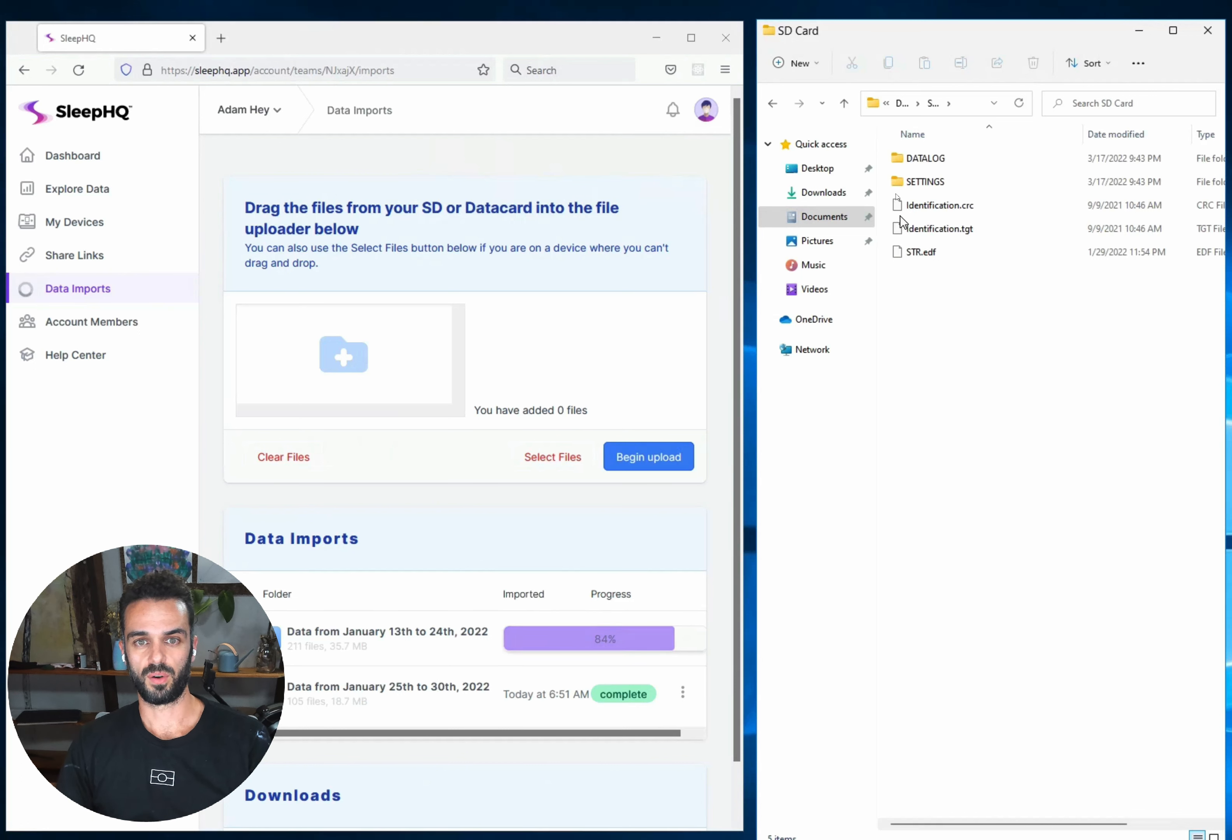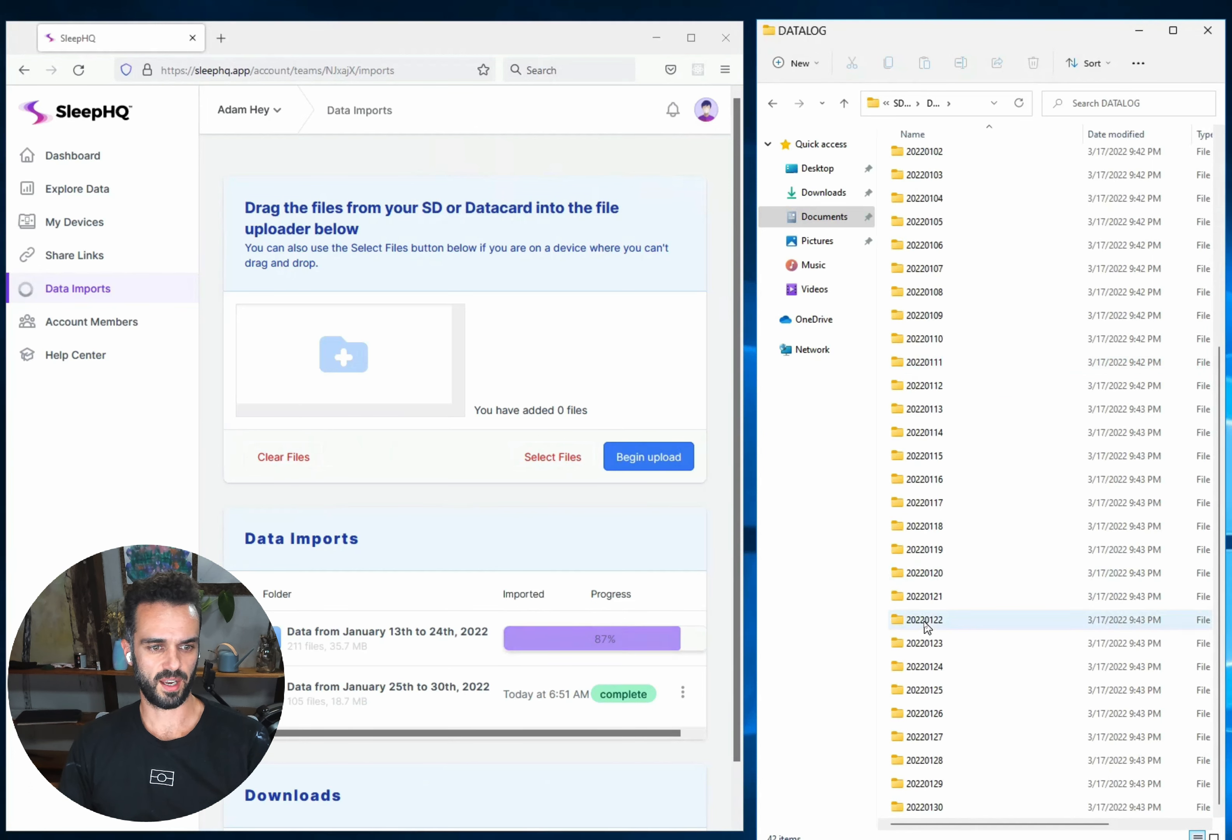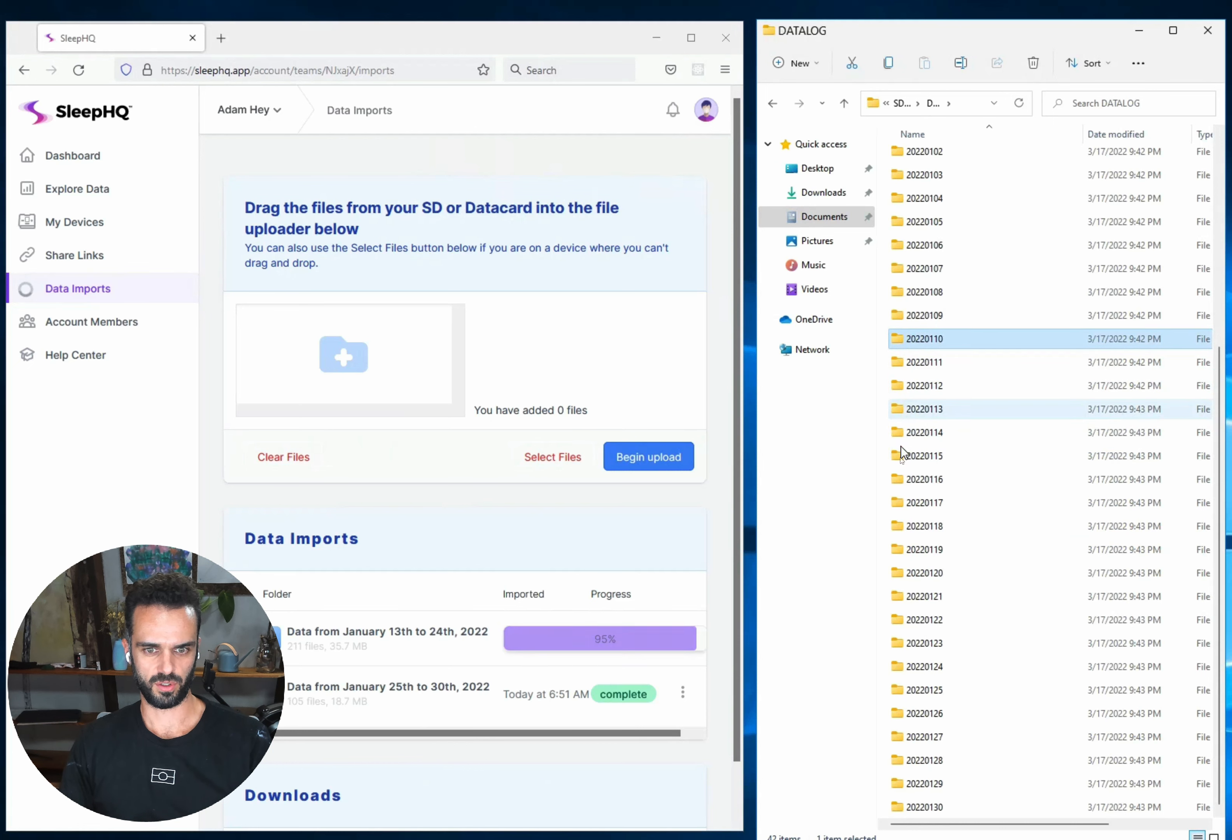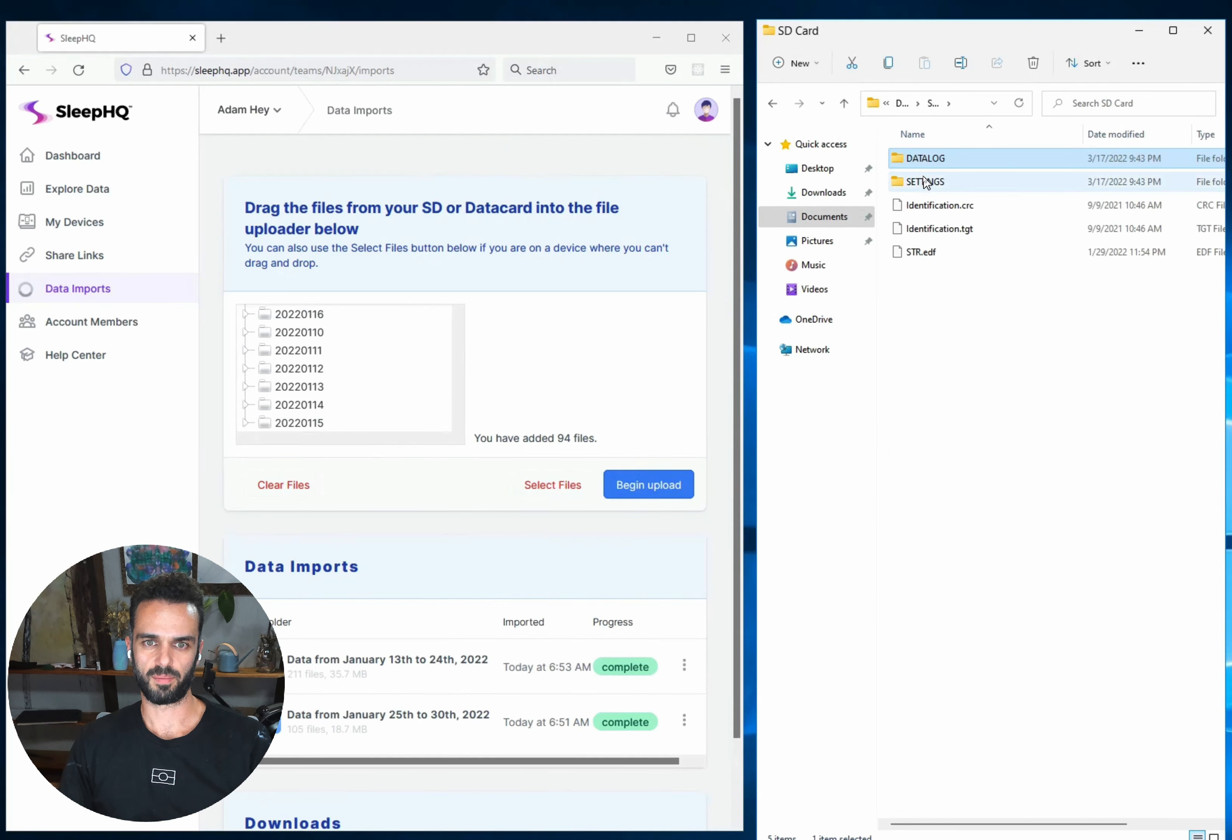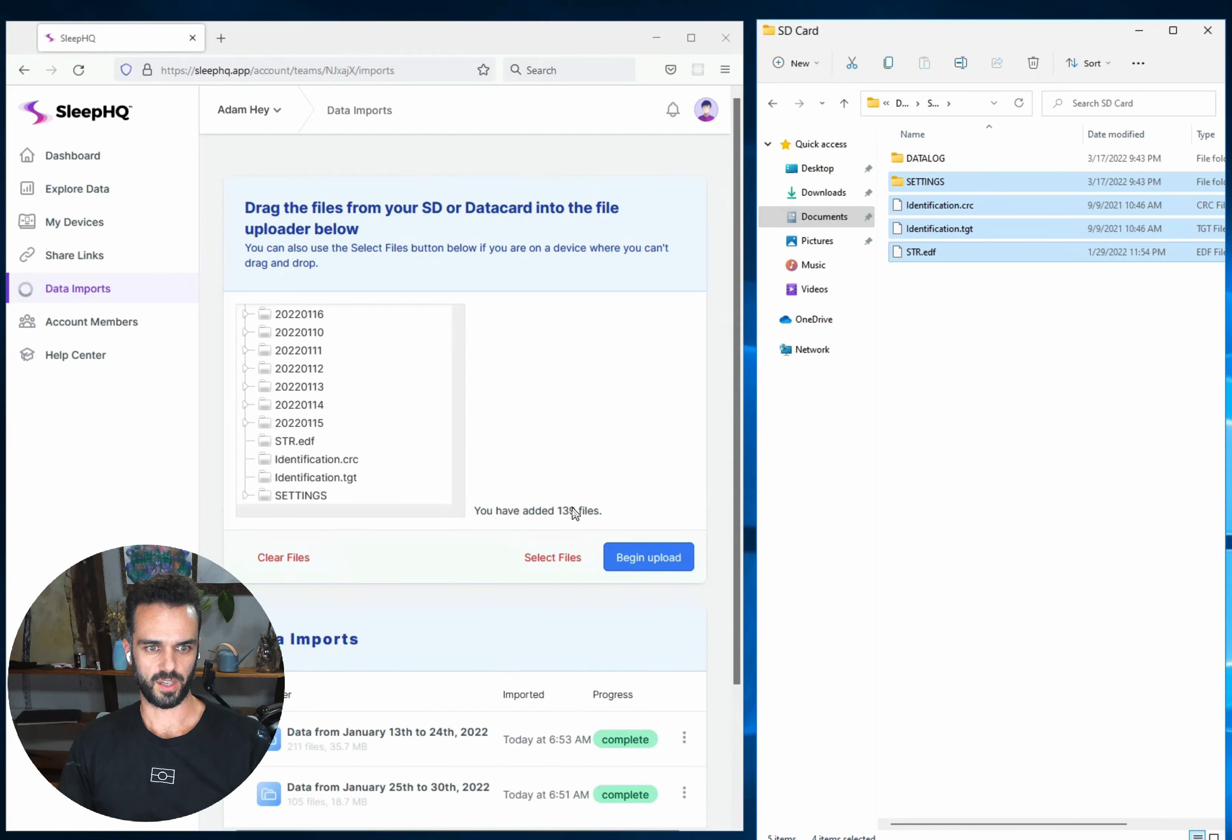You can go in there, go into your data log folder. If you do duplicate some of those days, like say I was going to upload now from the 10th to the 13th of January. Let's do this as a little demonstration. We're going to grab everything from the 10th to the 16th of January. So we're going to double up on some of that data that we've already imported. And now I'm going to grab my top level folders because I always need to drag them in. So we're adding 139 files and I'm going to say begin upload.